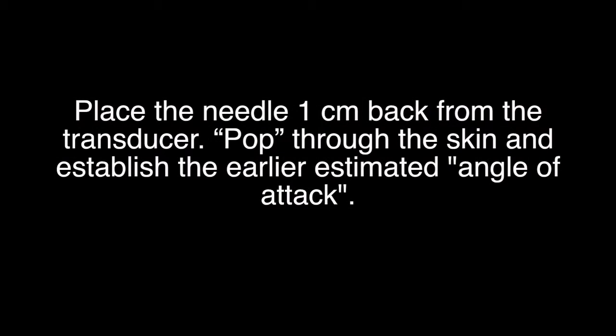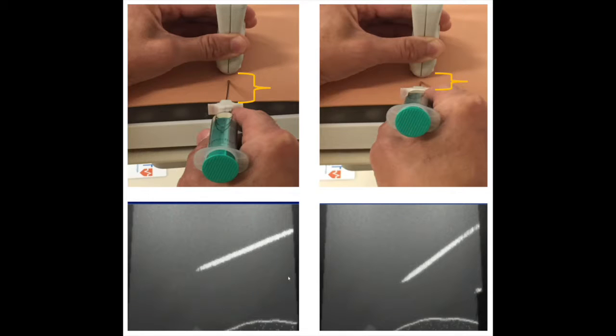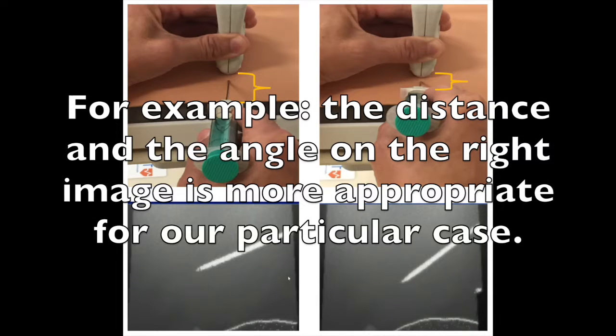Place the needle one centimeter back from the transducer. Pop through the skin and establish the earlier estimated angle of attack. The surrogate marker for the angle between the needle and the surface could be the distance between the needle hub and the transducer from your point of view. Pay attention to this distance during practice so you can set the appropriate angle when you need it. The distance and the angle on the right image is more appropriate for our particular case.